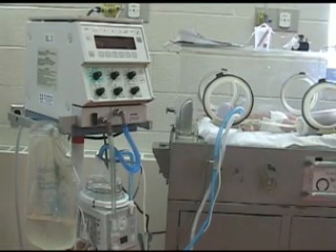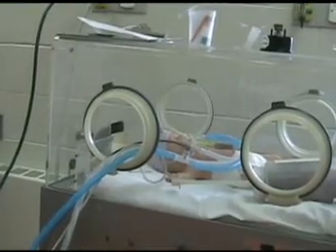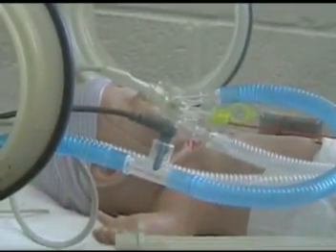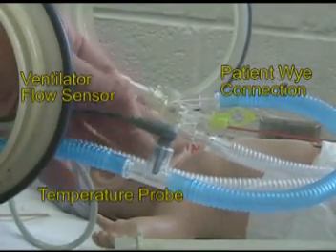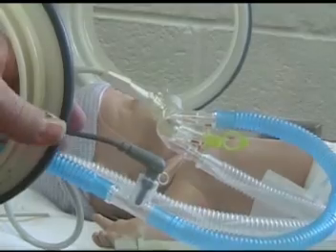This is the Draeger baby log ventilator. Let's take a close-up of this patient and the ventilator. Here we see the infant connected to the endotube, and there are a couple of important aspects to notice — one is this temperature probe at the patient, within about 12 inches.